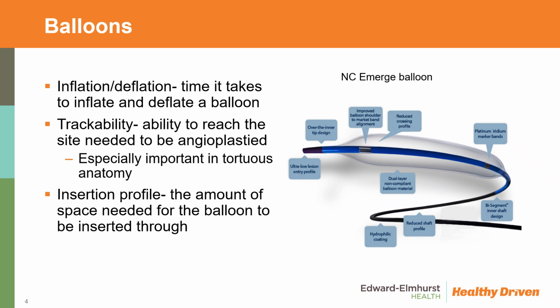So balloons, we have the inflation and deflation. It's that time that it takes to inflate and deflate a balloon. There's the trackability we want to focus on, which is the ability to reach that site that needs to be angioplastied. And you'll hear that a lot, especially in CTOs, where it's very tortuous and tight to get to our lesions. And then the insertion profile, which is the amount of space that's actually needed for that balloon to be inserted through.